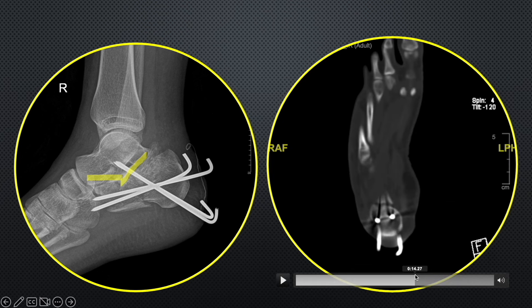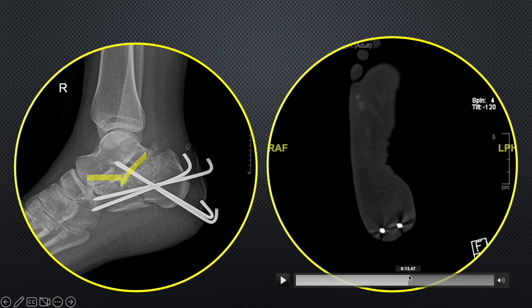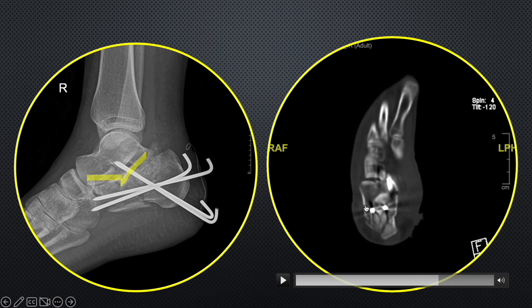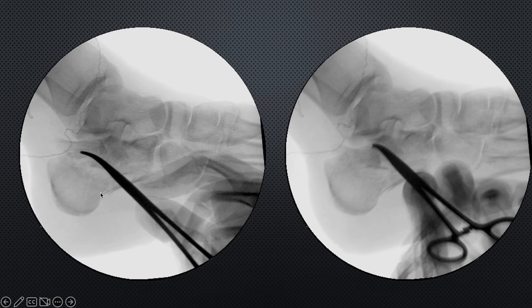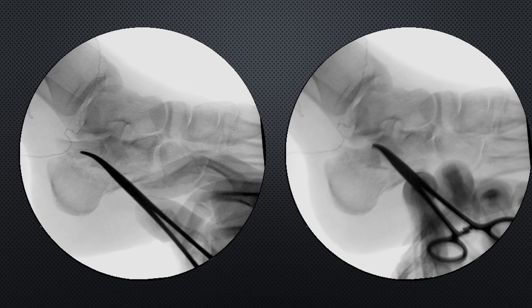This is a better axial cut compared to the previous CT. You see the lateral wall here and this part is the tuberosity. The white flare represents the depressed posterior facet fragment that should not be lying here — it should be lying under the surface of the talus. When we took the patient for revision we found that this fragment is very unstable — the posterior facet fragment can move in any direction. You need to see the joint under direct vision to restore the articulation of this fragment.